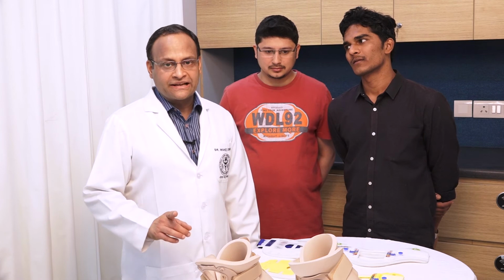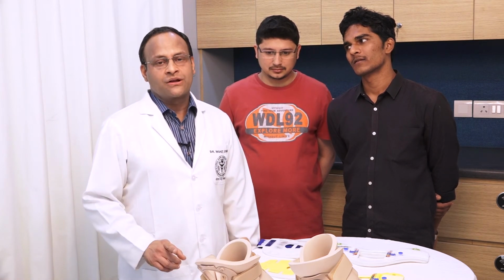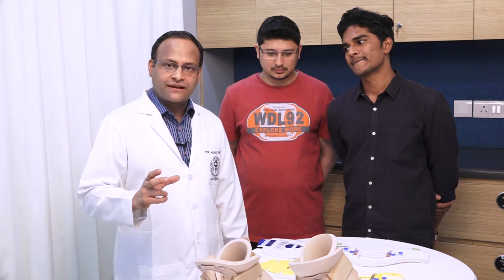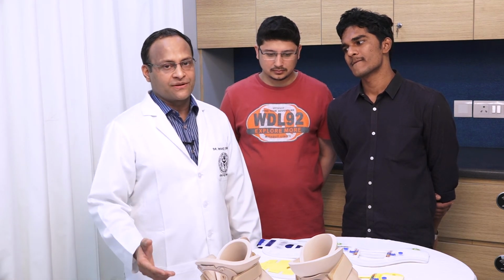So as application of a cervical collar is an important clinical skill, every healthcare worker should be aware of how to measure the right size of the cervical collar and how to apply it in our patients.